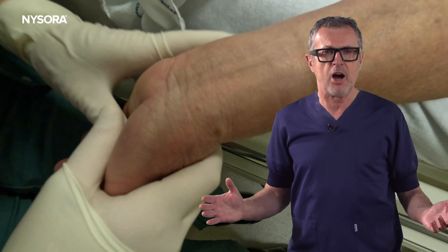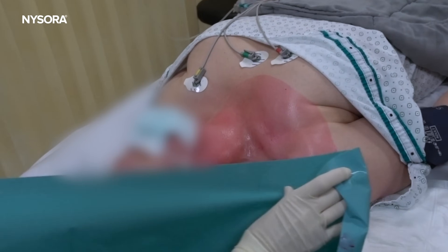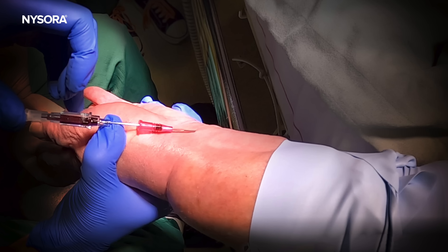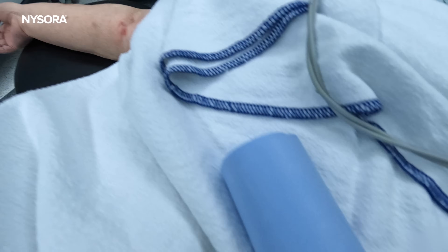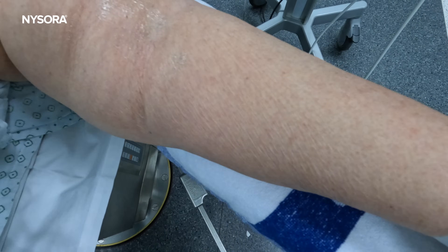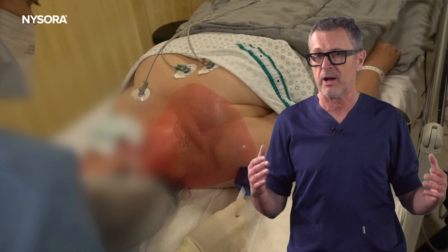Your typical options are to look for another IV in the upper extremity or attempt external or internal jugular vein access — but this patient will be quite difficult to access around the neck area. The IV stick was difficult in the upper extremities to begin with, and now with vasodilation under anesthesia there are no visible or palpable veins. Ultrasound or EJ/IJ access are options but require time, leaving the patient without urgently needed therapy.